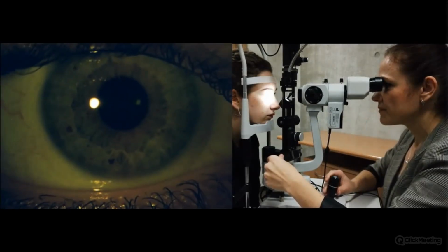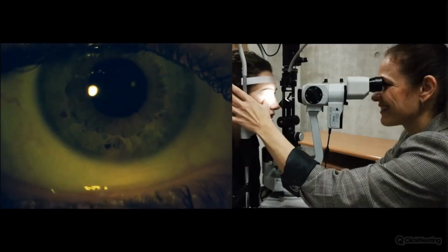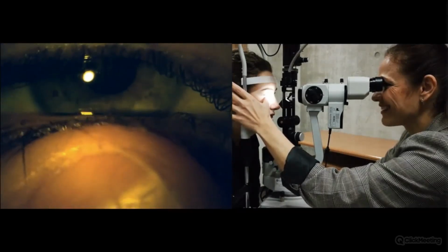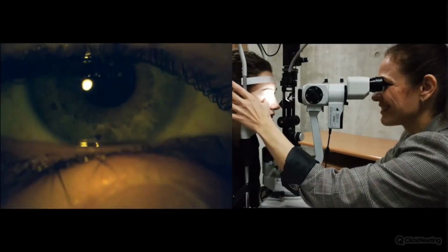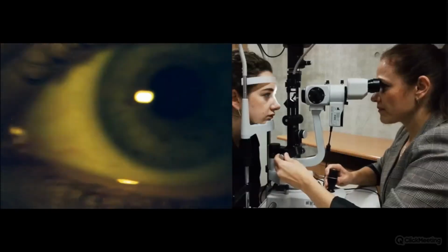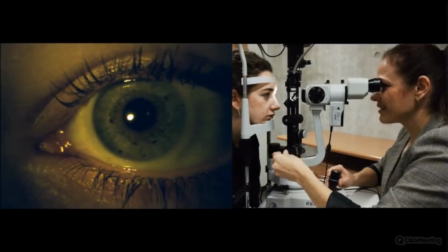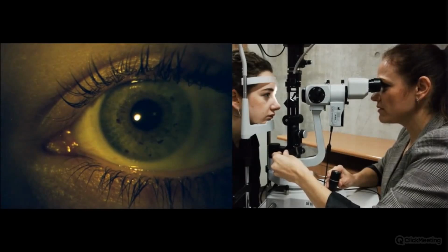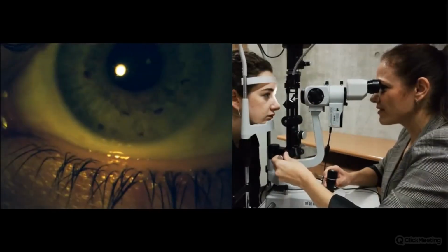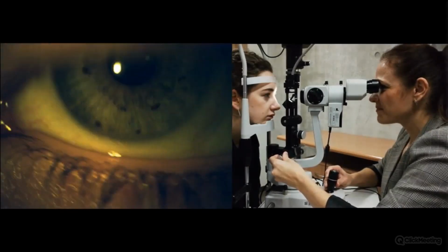Once more, just now I make a push-up test. Push and look at how fast the contact lens returns into place. In my opinion, the normal position is around 75%, depending on how strongly you need to push. If you need to put more intensity to push up this contact lens, it's a sign of a too tight contact lens fit.